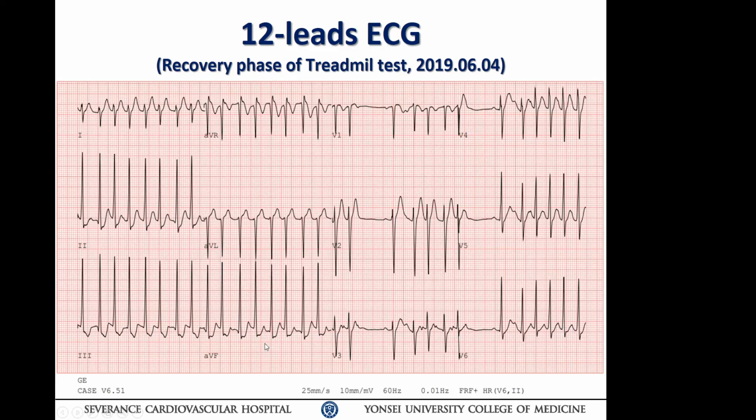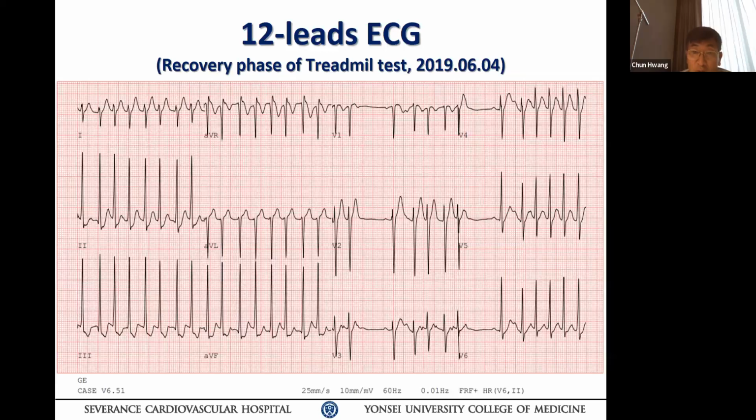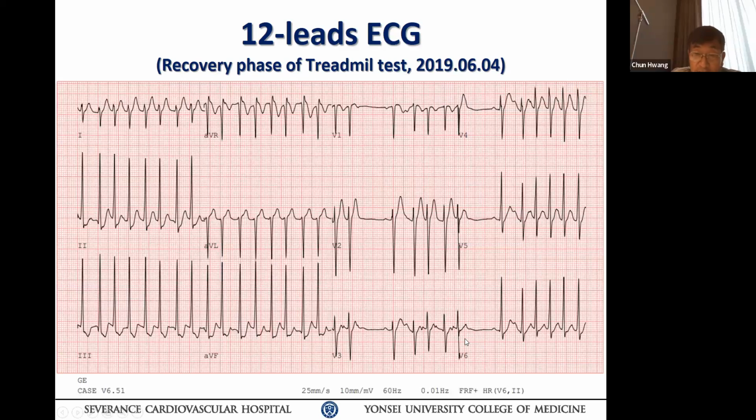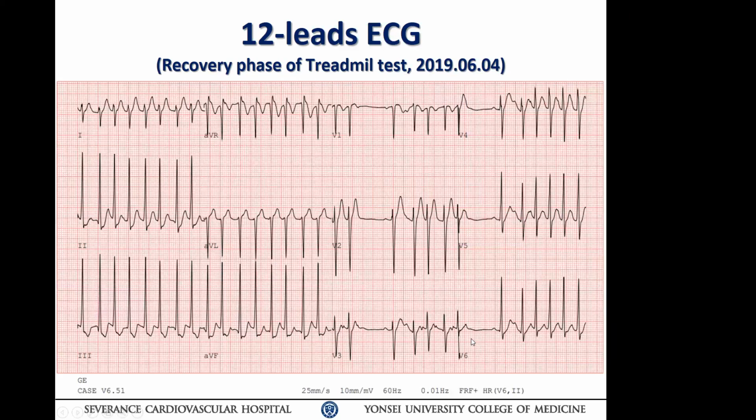근데 선생님 V3에서 V6로 넘어가는 순간에 커뮤니케이션이 돼가지고요. 그래서 잘 모르는데, 똑같이 있는지 없는지는 잘 모르고. 하지만 mechanism wise V3에서 우리가 볼 수 있는 거는 heart rate가 widely vary하고 P wave가 distinctively visible. You agree with that? V3. 그 다음 거. Sinus, PAC. Then you have a P wave, tachycardia, P wave, tachycardia with the RR interval changing. You agree with that? That's a mechanism, still you think the AVRT?